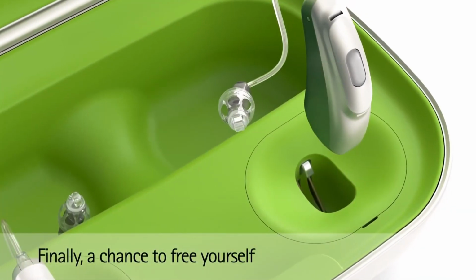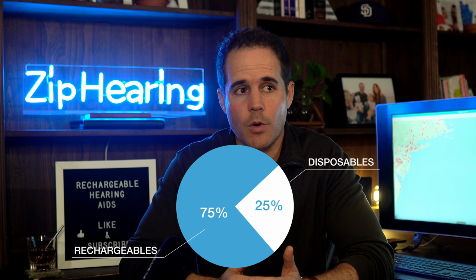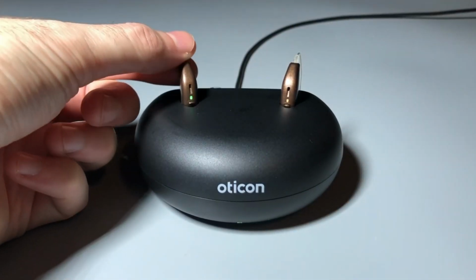These have really become popular in the last few years. I have felt like we were getting more and more rechargeable orders, but it wasn't until the last few months that I actually looked at the numbers, and it's like 75% of our customers now that are ordering rechargeables, and that number will probably continue to grow. It's definitely the way things are going. I mean, Oticon recently, one of the biggest hearing aid manufacturers, with their latest hearing aid they released called Oticon More, put a video there. They only released it with rechargeable batteries. I don't think that's ever happened before, but it just shows you where things are headed.